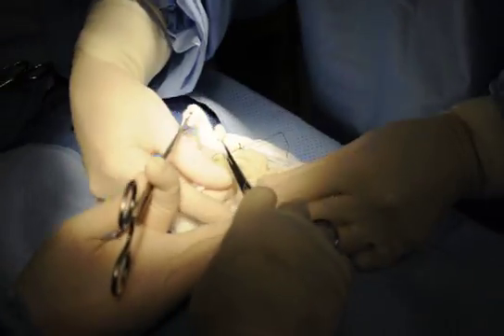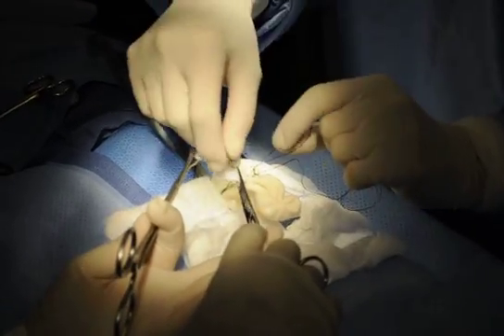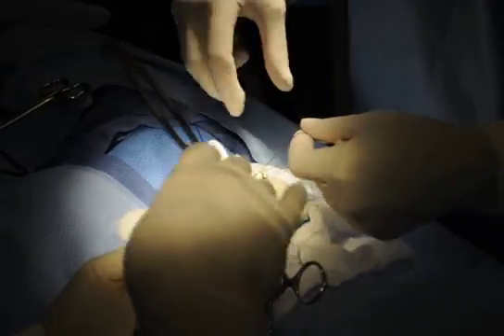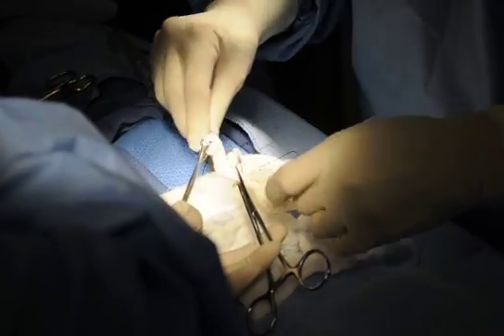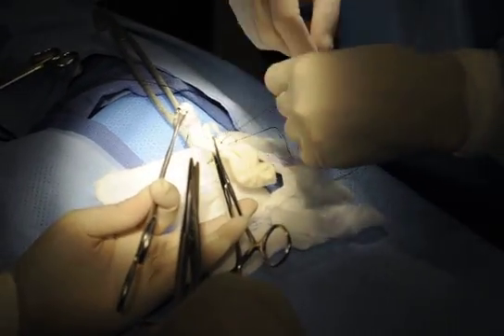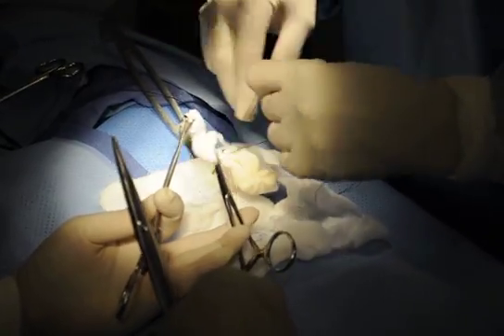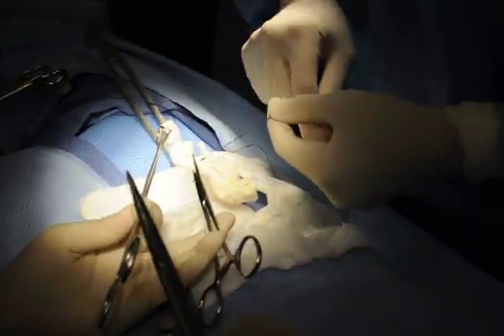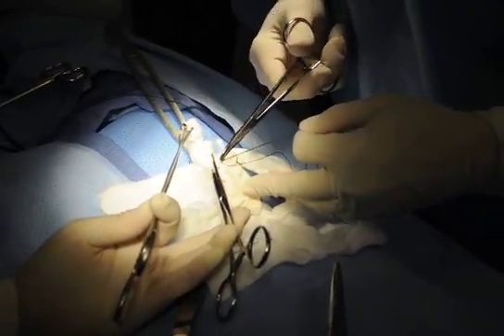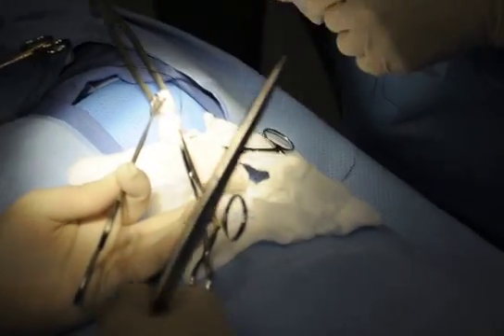What's not tight enough? It's moving around — this will never stay on. Put a nice long one on there. So they're going to put this on here, then cut. That's so I can dunk it.